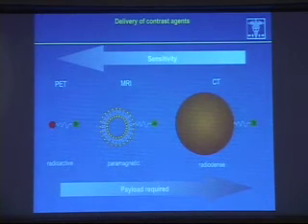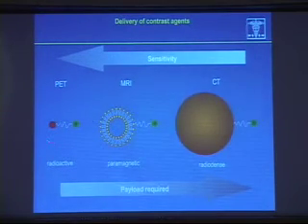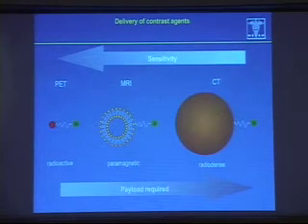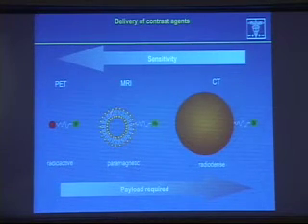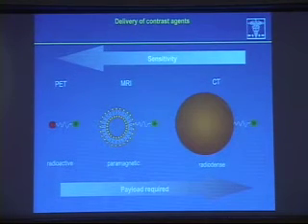So really, why is this important? Let me repeat this, okay, I have 5 more minutes. Oops. So why is this important? Because if we are using scintigraphy or radiopharmaceuticals, we will not be needing this delivery aspect. We are so sensitive, we inject such a small amount of contrast in this technique because they're really sensitive. But if we now want to use MRI or CT, we have to improve that sensitivity. One way to do this is to get into the aspect of payload, to try to create some kind of small delivery system that takes all this contrast agent and delivers it to the area of interest.